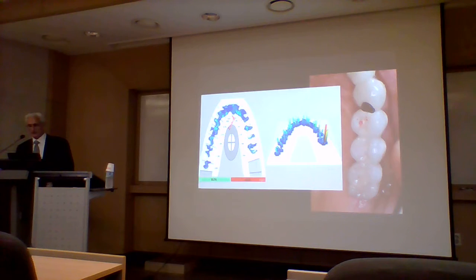So in the same way that we just did with that denture prosthesis, we go through the process of adjusting the highest forces, correlating the articulating paper marks to the T-scan data. As with the denture, we look at which areas are marked most and adjust those.